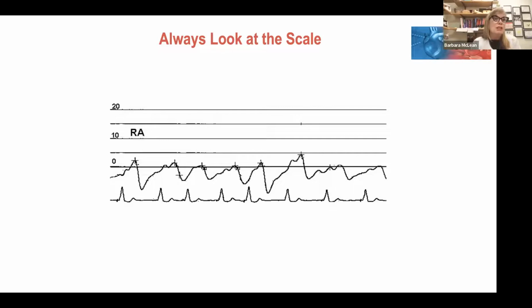Now, everyone says to me, well, Epic won't let you chart a negative pressure. Why is Epic telling me what I can chart? It allows me to chart a CVP of 180 and give an SVR of negative 2,385. Why can't I chart a negative pressure? Mostly you can, but you have to understand it, and you have to be able to justify it.